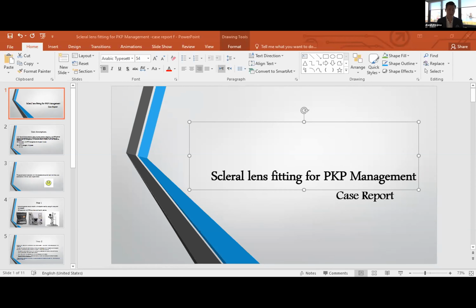But fogging is simply a problem in scleral lenses, it's kind of the Achilles heel. We haven't figured out exactly how to address it. I can just say that for us at the university, it's been a huge change going to a toric landing. That's almost eliminated fogging altogether. It's been incredible how just using a toric landing has changed how often patients fog. I hope that's helpful. Thank you, Randy.